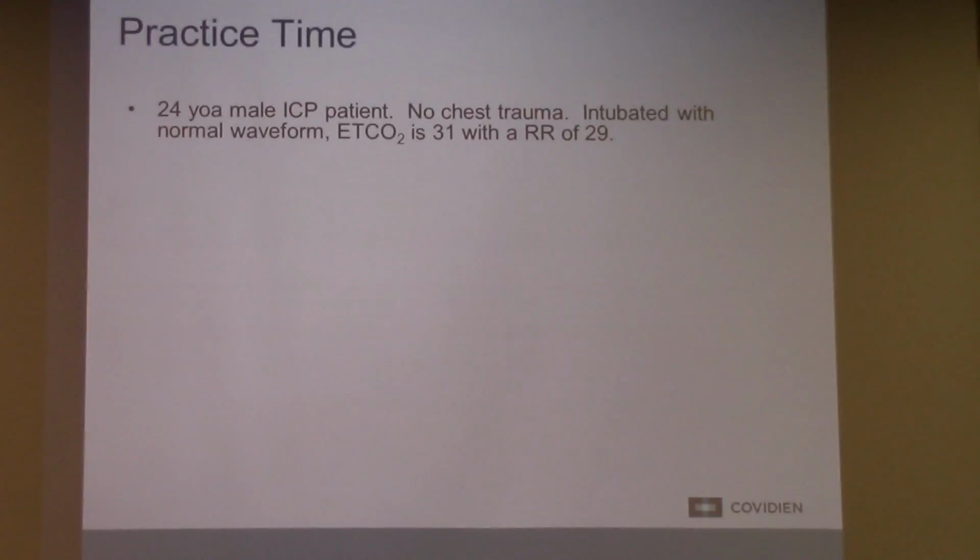Okay, I still intubated him, left the bag on high flow oxygen, because if I would have ventilated him to make myself feel better because he's intubated, what would I have done? Let's say I add 5-6 breaths on there for my sake. It would have done what to his CO2? Dropped it below that 30. And in the PIC study, more than likely, what have I done? I've done more harm than good because I'm at detrimental perfusion levels, okay?